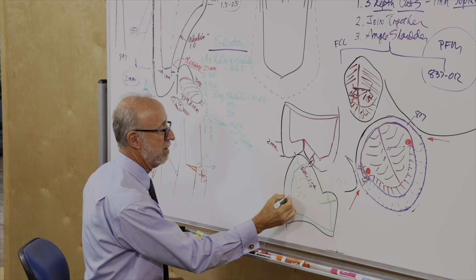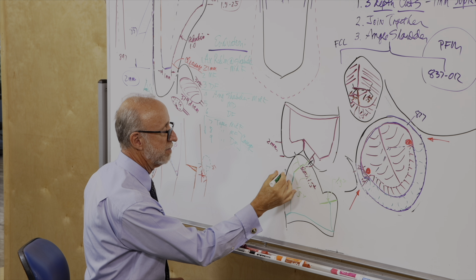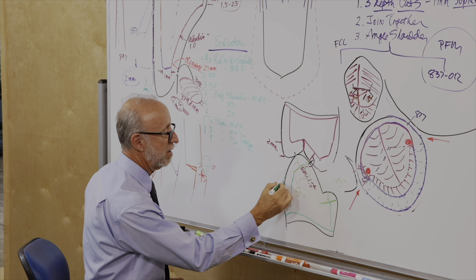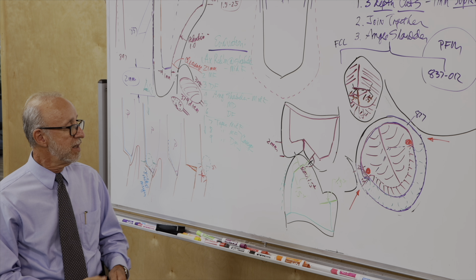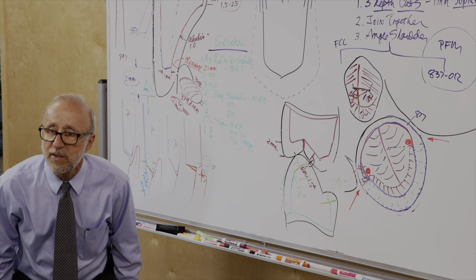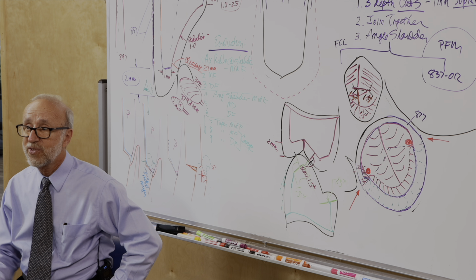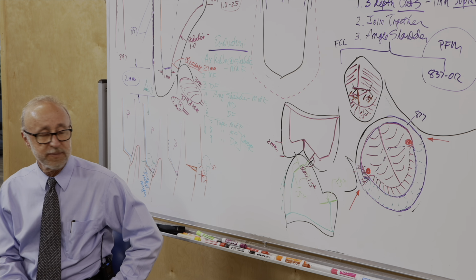Again, take the taper on the midfacial from the midfacial. Take the taper for the secondary plane from the occlusal third. Then you get your angle. So it's the same thing on the lower arch. You just have to look on the lower carefully at finding the middle third and trust that that's the angle that you need to have.